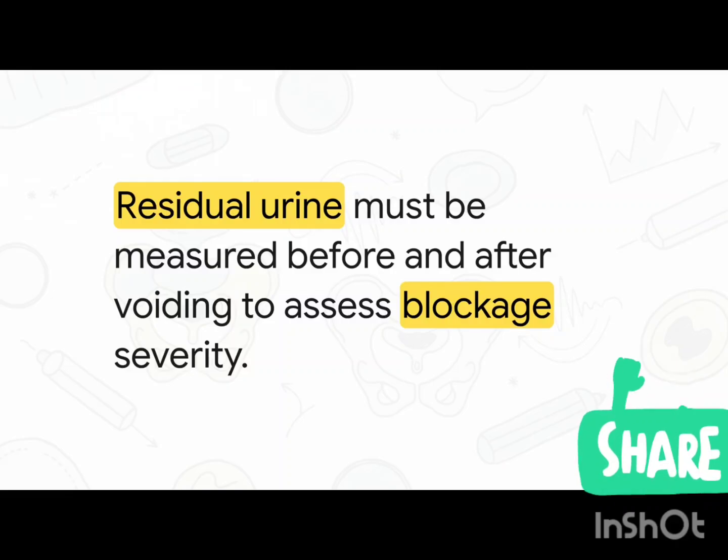obstruction. To figure this out, the sonographer scans the bladder before the patient empties it, and then, you guessed it, scans it again right afterward. This lets them measure the increased post-void residual urine, that's just the fluid left behind. Documenting this residual volume is an absolutely vital part of the exam because it tells us the true severity of that physical blockage. It's the so what of the whole situation.